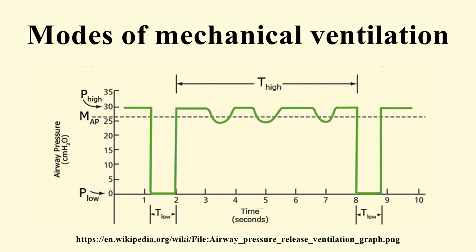Patient cycling means ending inspiratory time based on signals representing the patient-determined components of the equation of motion. Flow cycling is a form of patient cycling because the rate of flow decay to the cycle threshold is determined by patient mechanics. Machine cycling means ending inspiratory time independent of signals representing the patient-determined components of the equation of motion. Breaths are classified as spontaneous or mandatory based on both the trigger and cycle events.